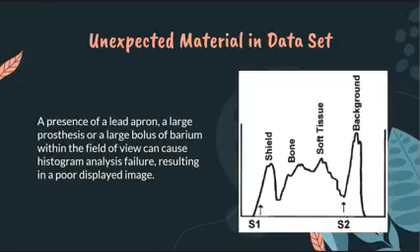Okay? The computer tries to identify the normal anatomical densities within the image as the bell-shaped portion of the curve extending from S1 to S2. So, gina-identify na yung asa man dire. Okay? Saan dito ang anatomy? Okay? So, the computer ends up identifying both the shield and the background density. Okay? So, this will result to this type of histogram.